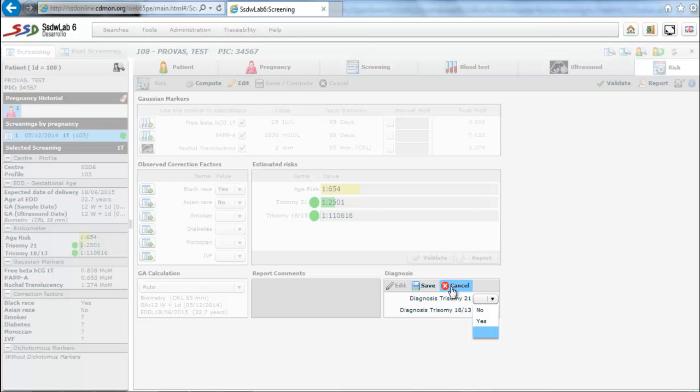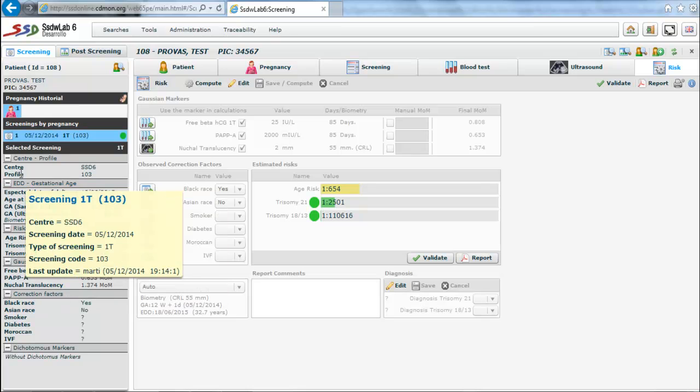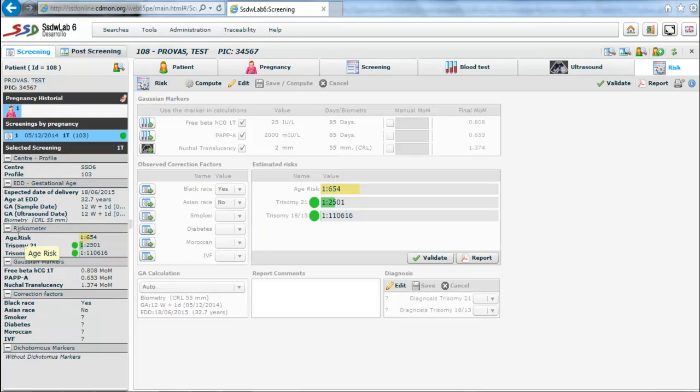On the left side of the screen there is an informative summary of the patient's screening where appears the screening date, the center, the screening profile, the gestational age, the risks, the MOMs of Gaussian markers, the correction factors and dichotomous markers if they have been used.